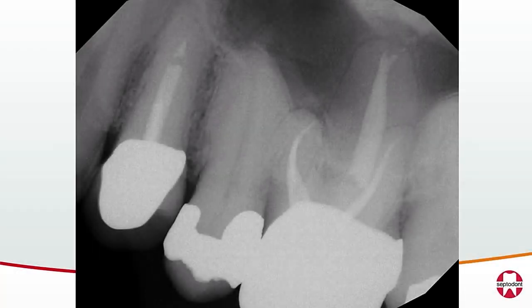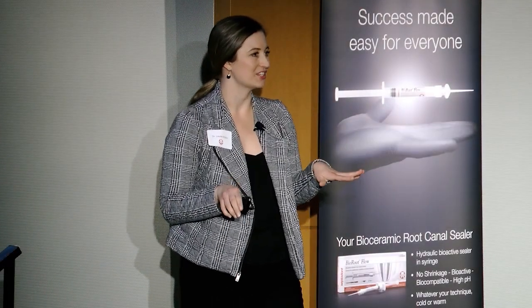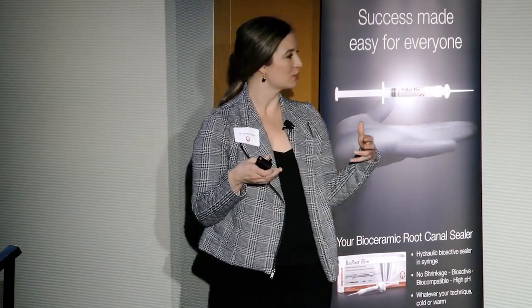And then you can see this number 14 that I completed on a younger patient, very large palatal canal. I did end up doing cold lateral here. This is quite large, but you can see this almost forked tongue at the apex of the palatal root. And the BioRoot Flow did, in fact, flow down into there. And I like the fact that it's dimensionally stable, so it's not going to be shrinking and it's not going to wash out either.